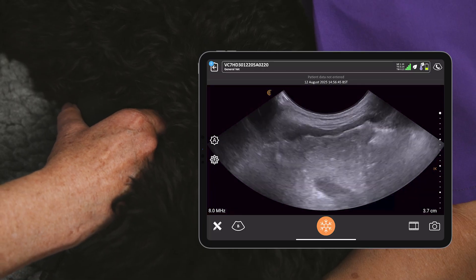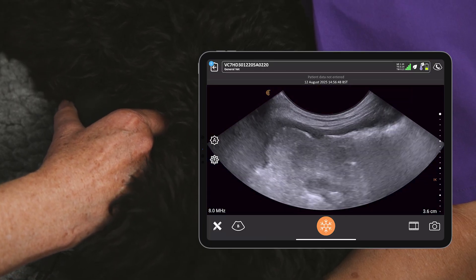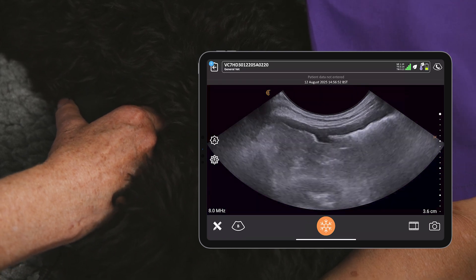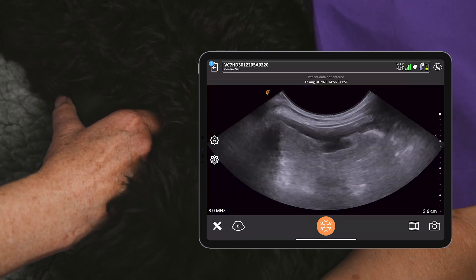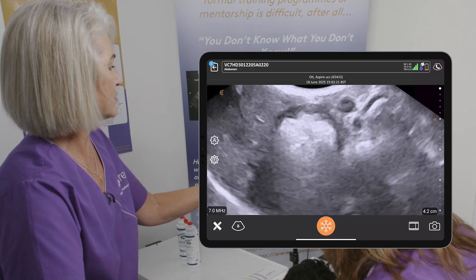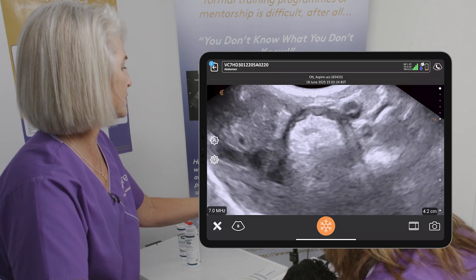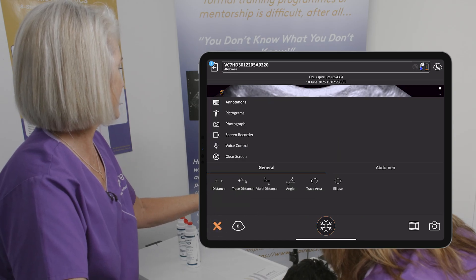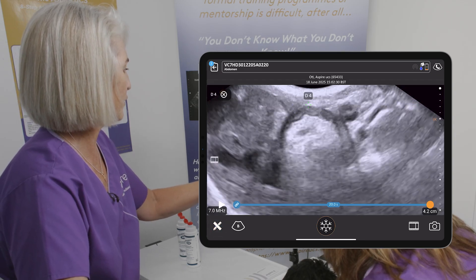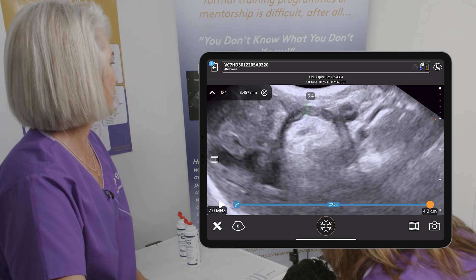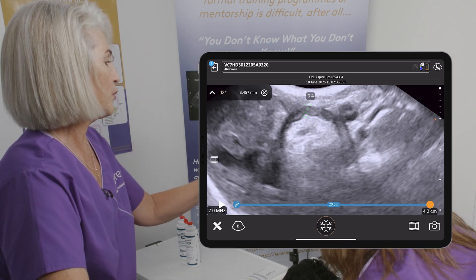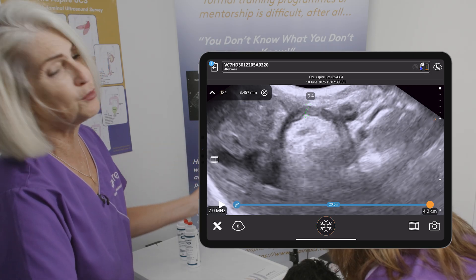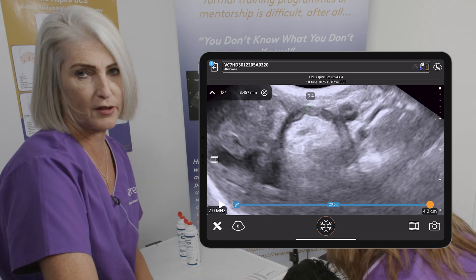You can see a little bit of small intestine there — it looks like a coffee bean but you can quite clearly see the black and white next to it. Oti has quite a lot of gas in her stomach and you can see it squelching around. I'm going to freeze the screen and measure a representative gastric wall thickness — 3.5mm, which is nice and normal. We want to make sure that that's uniform around the area of the stomach that we can see.